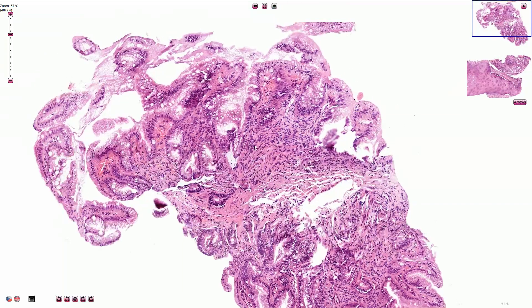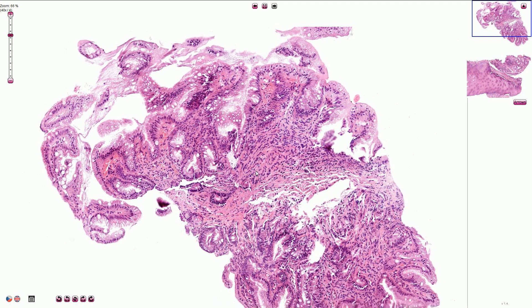So once again: columnar epithelium with multiple goblet cells and some inflammatory infiltration of the lamina propria.